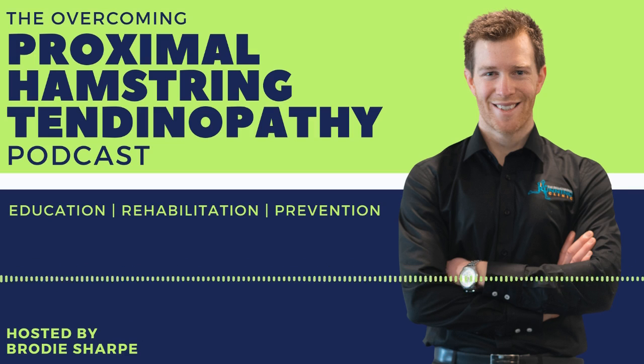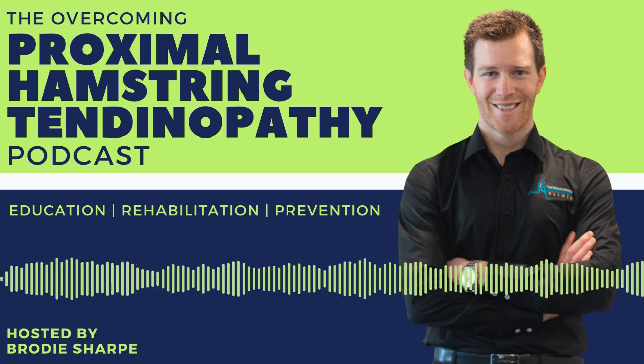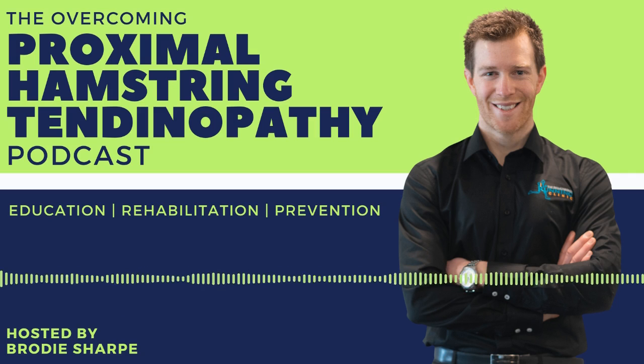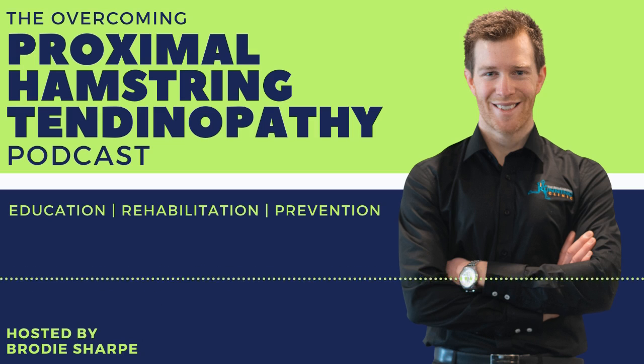The more chronic it becomes, for example if you've had lateral hip pain for 4 years, you know that with chronic pain you get a lot of changes: central sensitization, psychological issues, anxiety, depression, and also other associated factors like kinetic chain weakness. So generally, the more chronic they are, if a runner comes to me with lateral hip pain for 4 years, of course it's very safe to try shockwave, but I'm going to dampen their expectations. I'd say, you've had it for 4 years, and it's very unlikely that whatever we do, we're going to make it back to zero again. We can make it better, but please don't expect that I'm going to totally fix it.